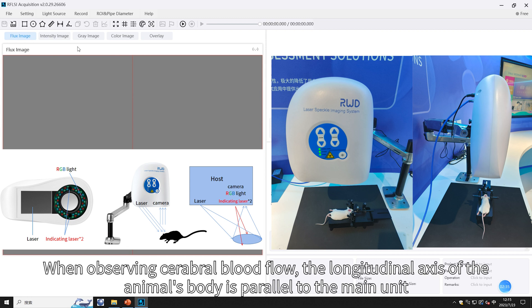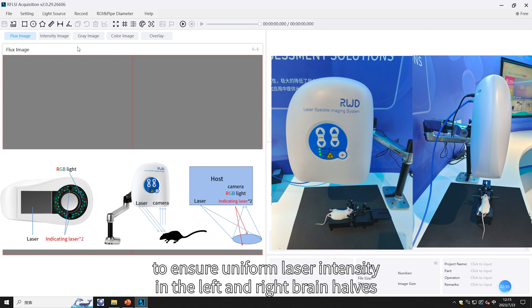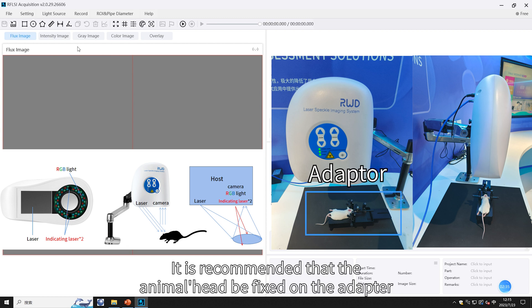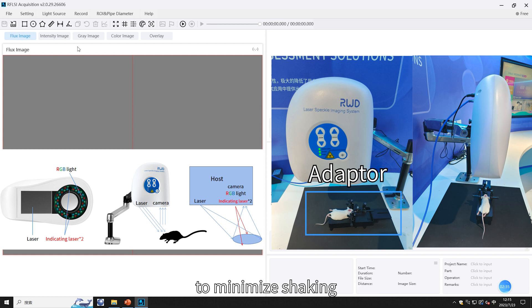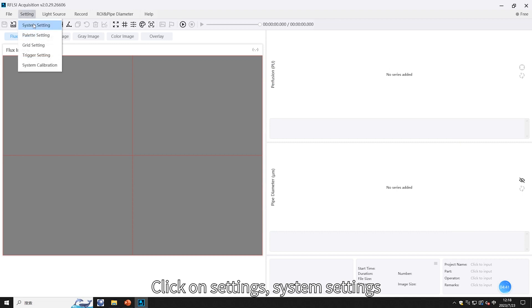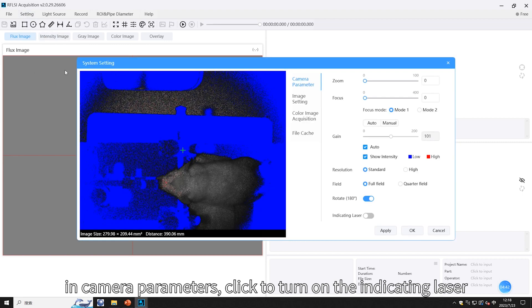When observing cerebral blood flow, the longitudinal axis of the animal's body should be parallel to the main unit to ensure uniform laser intensity in the left and right brain halves. It is recommended that the animal's head be fixed on the adapter to minimize shaking.